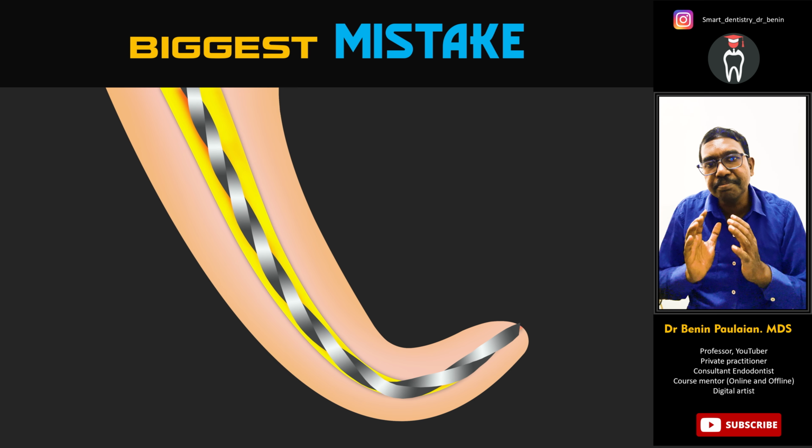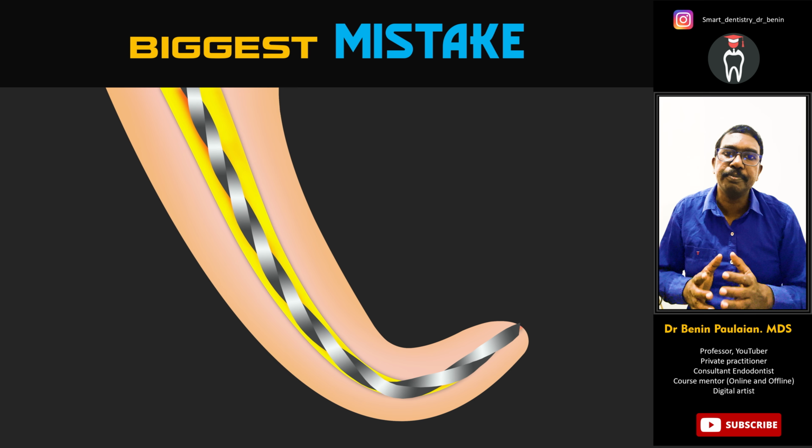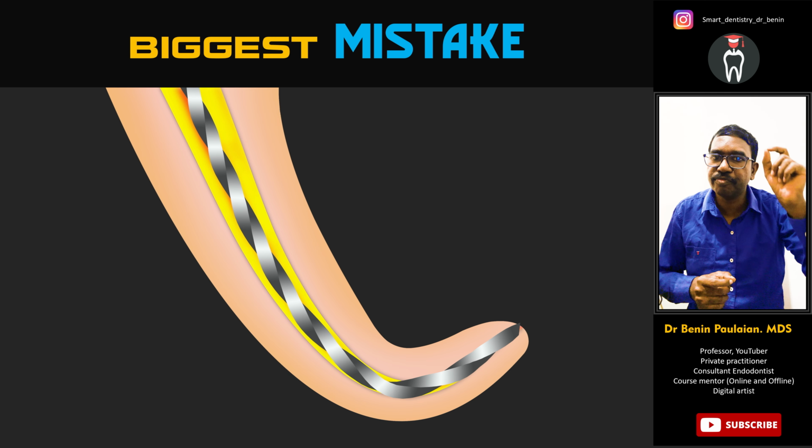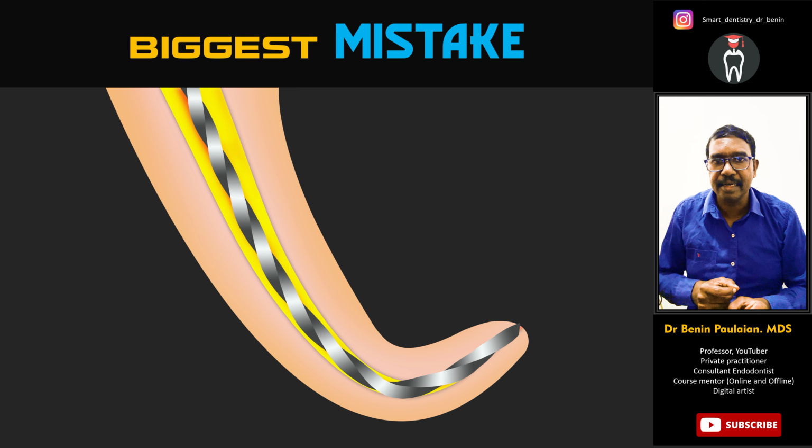One of the biggest mistakes or blunders that most people make in calcified canal negotiation is using a single file to negotiate from coronal till the apical end.